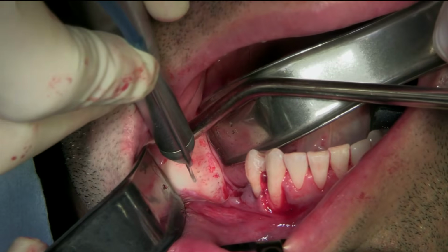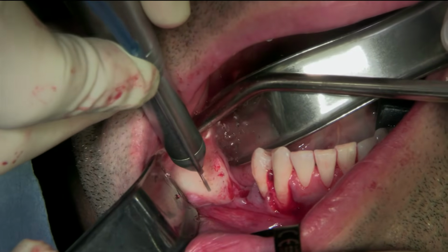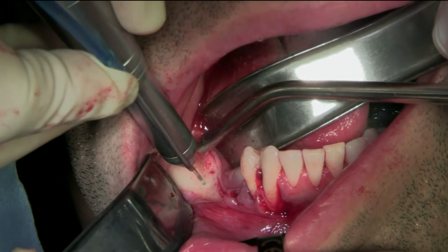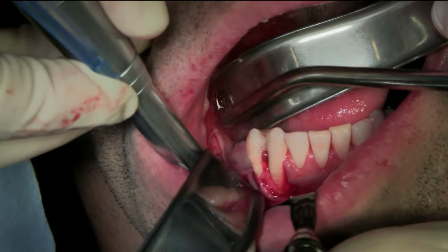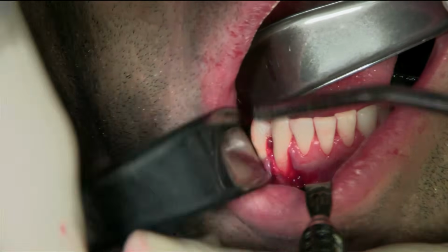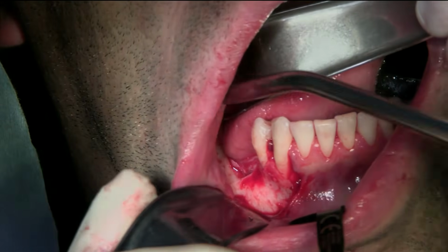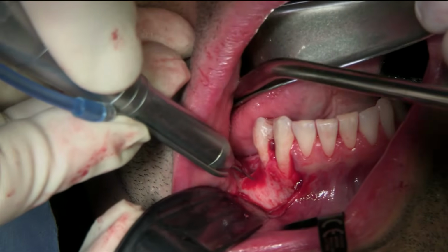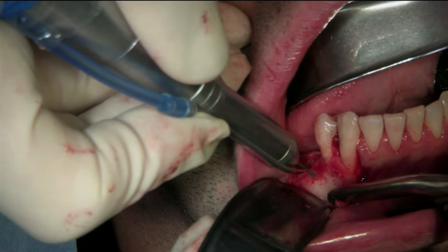About a 1 millimeter drill. 1.2. Very cortical surface, so careful here again with the mental foramen. A little bit to the left. A little bit to the left. Perfect, yeah.